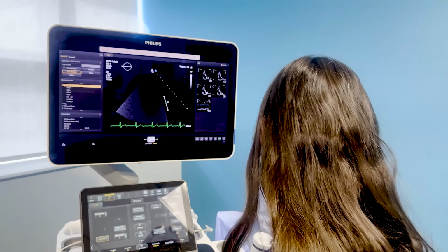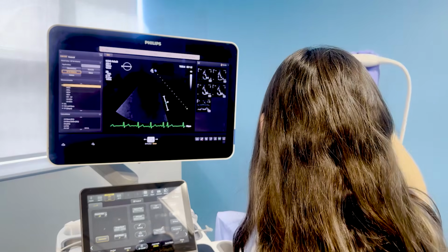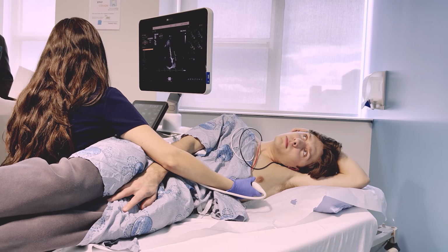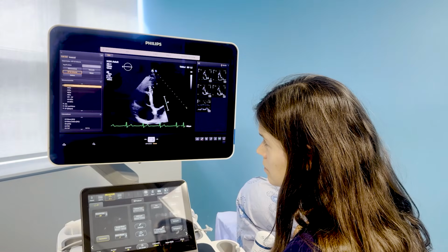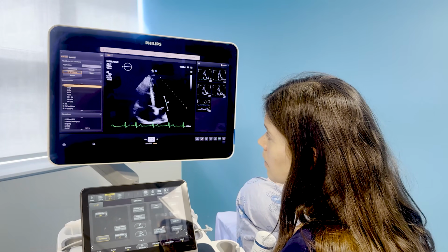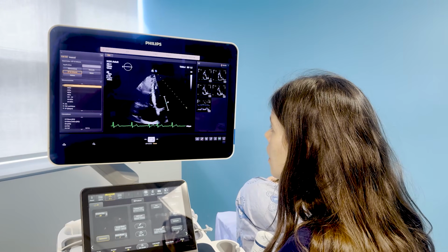So why don't we move on to how to obtain some additional measurements, including the sphericity index. So should we do that next, or would you normally do the pulmonary artery systolic pressure here, since you probably have a good look at the tricuspid valve?